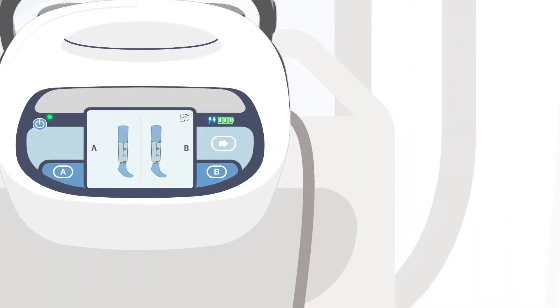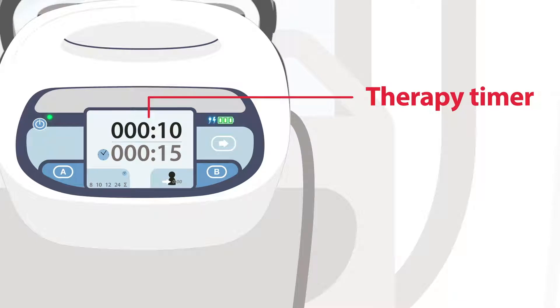To navigate to the compliance meter, press the right arrow button. The top number shown is the wear time by the patient or the therapy time, while the bottom number shown is the run time of the pump since startup or the elapsed time.